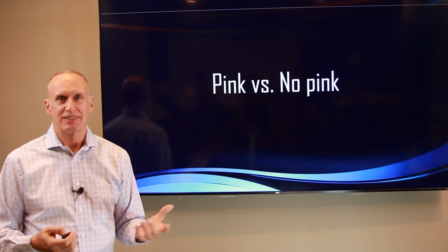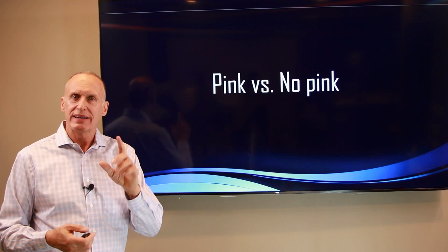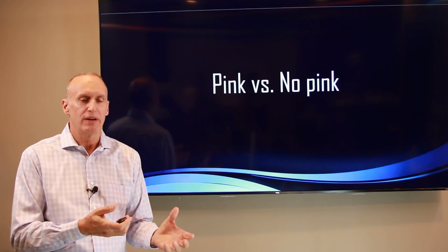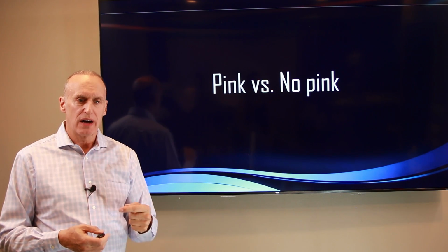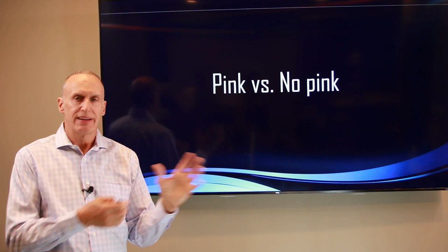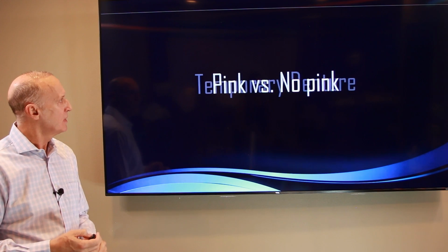And I've had a few patients tell me, demand, you said pink is bad. No, I didn't. I said people have pink on All-On-4s because they remove the bone. Our patients only get pink when I can't avoid it. But people get really hung up on the pink, and I don't want you to focus so much on that. And hopefully through this next few minutes, I'll explain that.